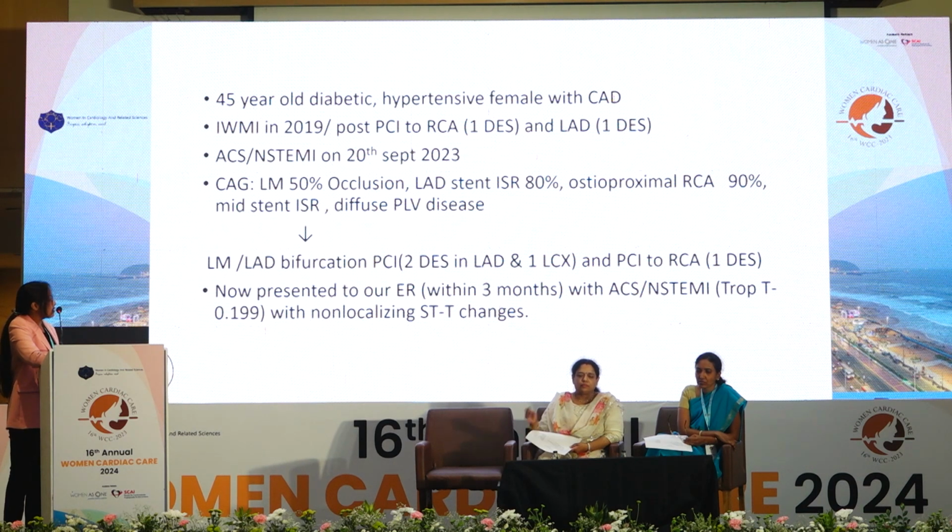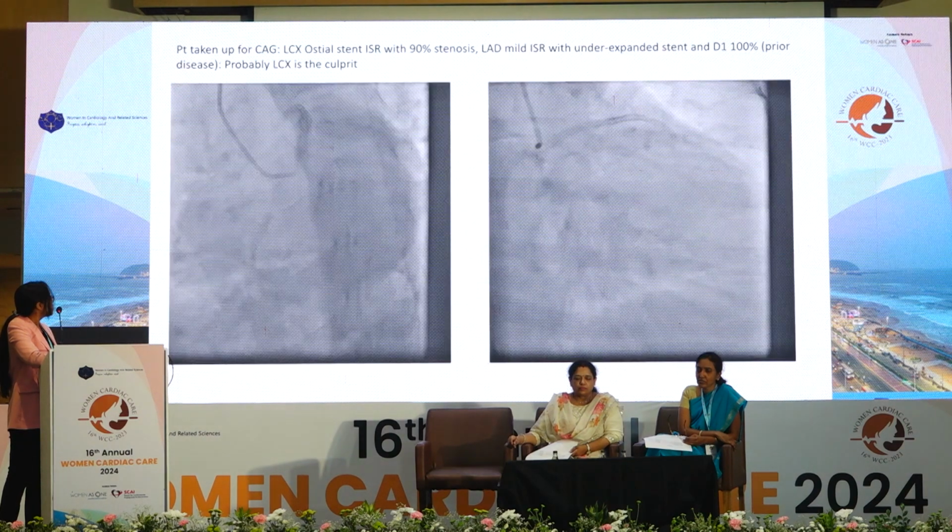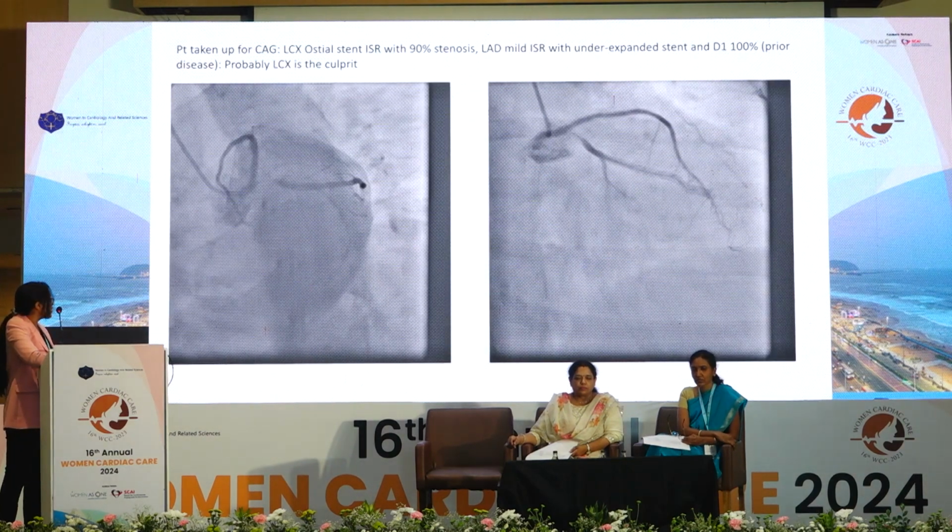She had left main LAD bifurcation PCI at that time with 2 stents in LAD and 1 in LCX, and PCI to RCA with 1 stent. Now she presented to our emergency within 3 months of this last NSTEMI with NSTEMI again, with no localizing changes in ECG. So we took the patient for coronary angiogram.